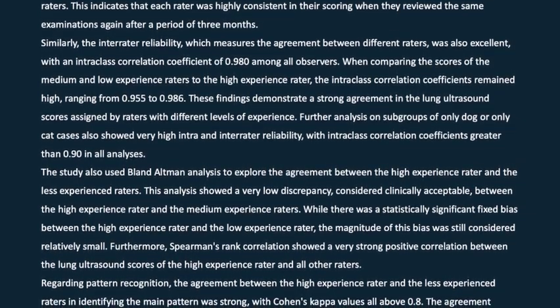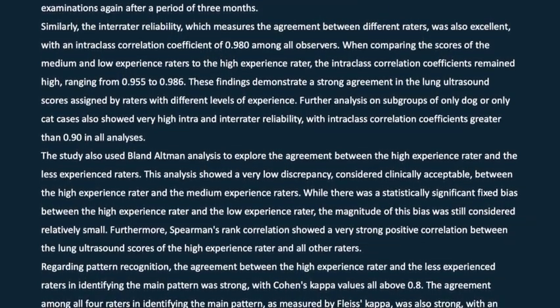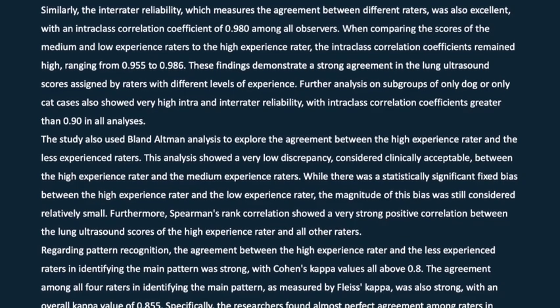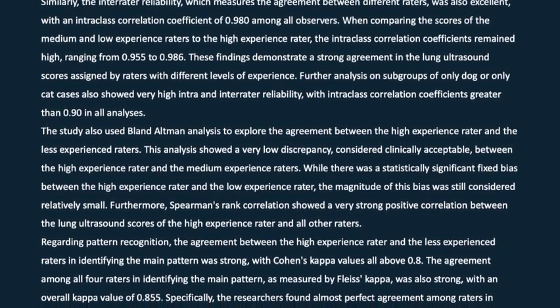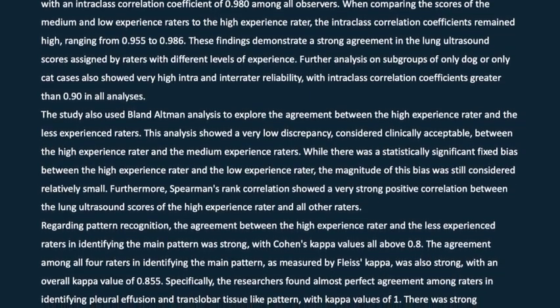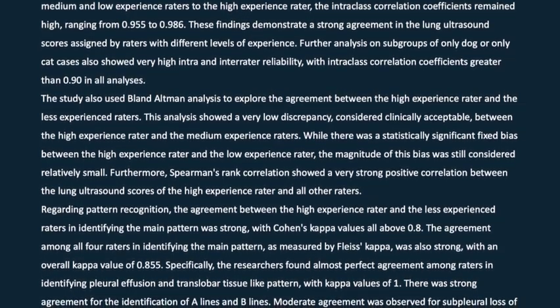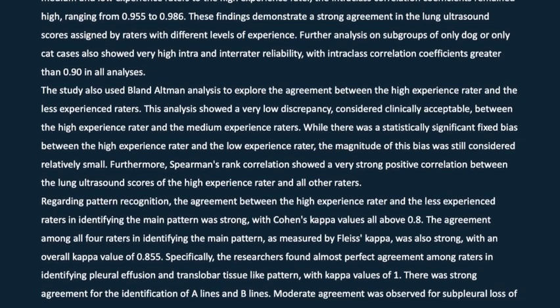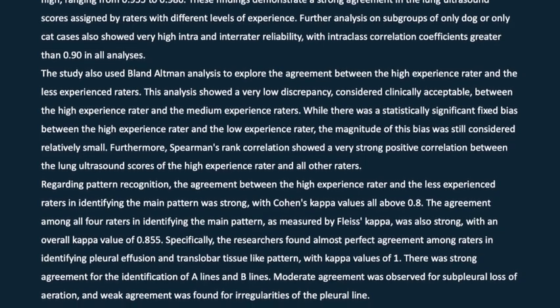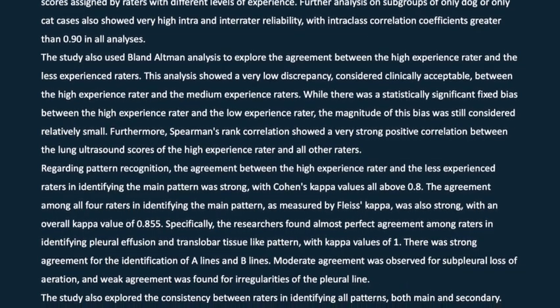Further analysis on subgroups of only dog or only cat cases also showed very high intra- and inter-rater reliability, with intra-class correlation coefficients greater than 0.90 in all analyses. The study also used Bland-Altman analysis to explore the agreement between the high experience rater and the less experienced raters. This analysis showed a very low discrepancy, considered clinically acceptable, between the high experience rater and the medium experience raters. While there was a statistically significant fixed bias between the high experience rater and the low experience rater, the magnitude of this bias was still considered relatively small.